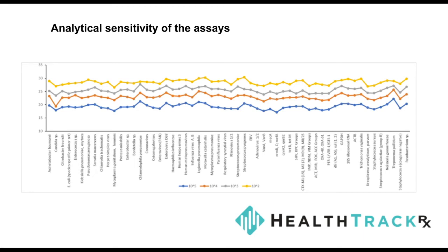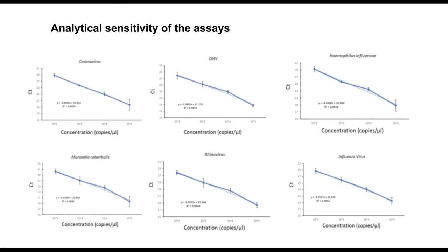And in the meantime, we kept working with a lot of sources, so public health departments, hospitals, clinics, in sourcing true known patient samples with clearly identified infections. And some of the relevant examples are here. And you can see that we could establish very good linear correlation for all of our assays. And that allowed us to define a lot of our test characteristics that are laid down by the different guidelines, whether they be from CLIA, CAP, or ISO, or the FDA.